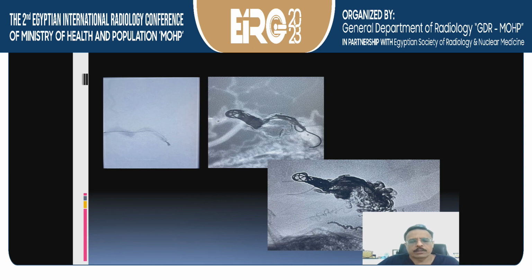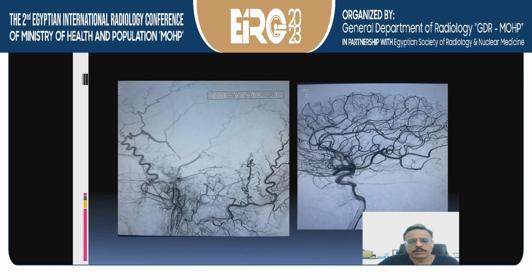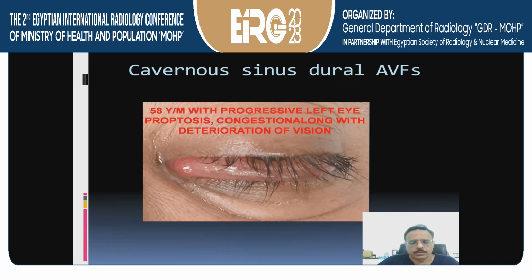So this is one microcatheter. Then we placed through the other these coils, and then we could inject the dural AVF completely to get a complete cure. So yes, transvenous route is very useful, particularly in some patients of this cavernous sinus dural AVF, because they will never have good arterial feeders. They will always have collateralization from ICA. So these cases you have to go transvenous.